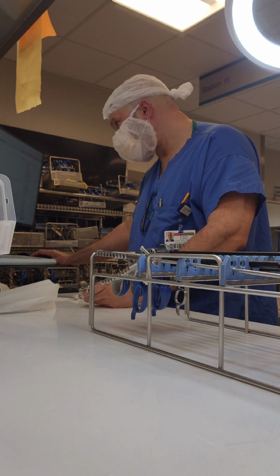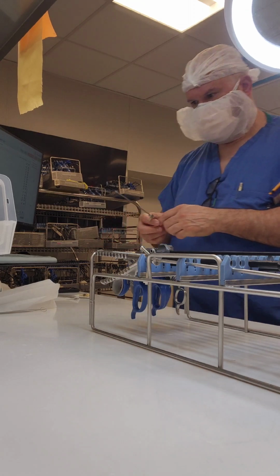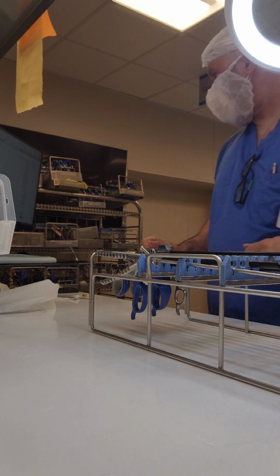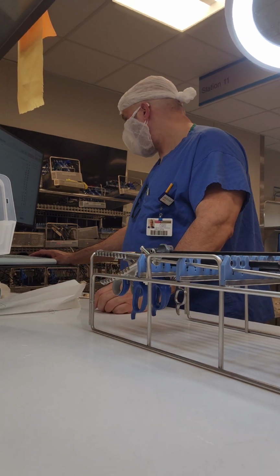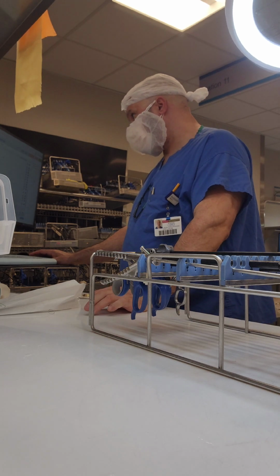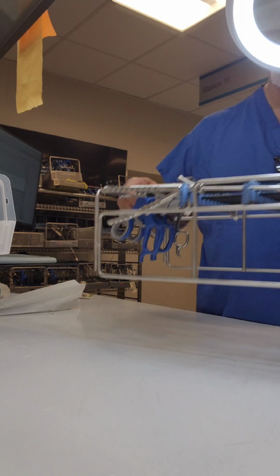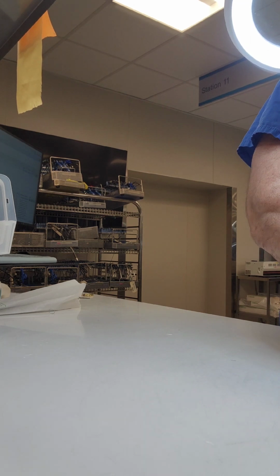Okay, I got an instrument in my hand here that I was like, wait a minute, I don't think I've seen this on a count sheet. Did I miss it? Again, making sure that I didn't miss an instrument. So that instrument did not belong on the count sheet, so I put that off to the side. Okay, there's all my forceps. Checking everything off. And now I am going to print off my count sheet and my tags. Putting everything together here.